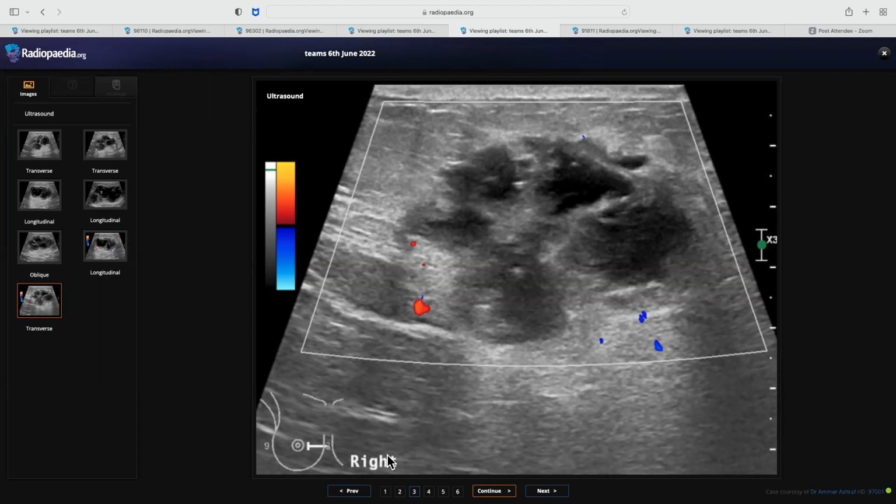So that cannot be MRI, right? What else? Anything else comes to your mind? So you are asking before mammogram. So once you see the abnormality on the mammogram, what will you do? We can have further views like magnification views and compression views. Okay, let's move on. We'll discuss that later.